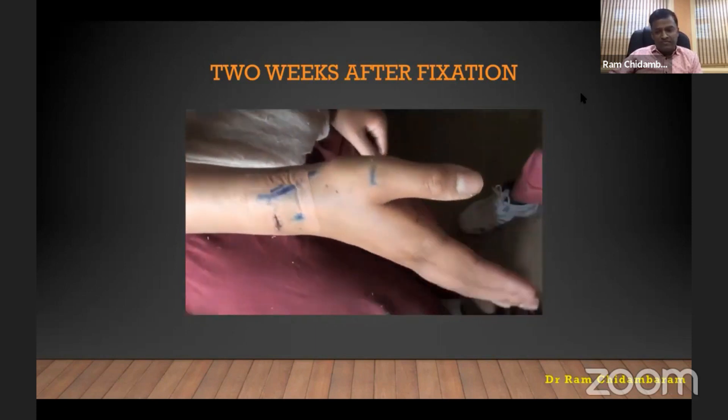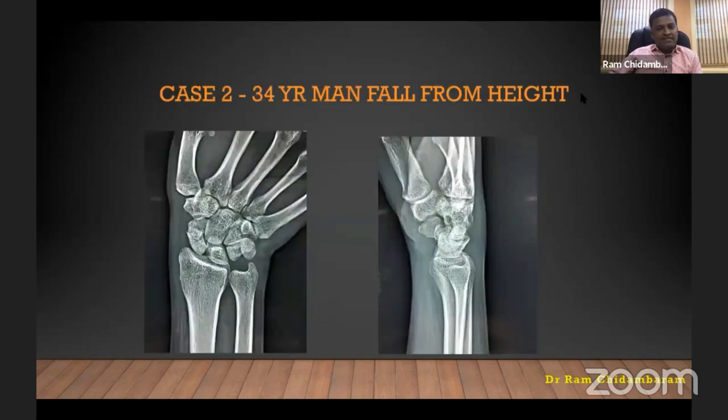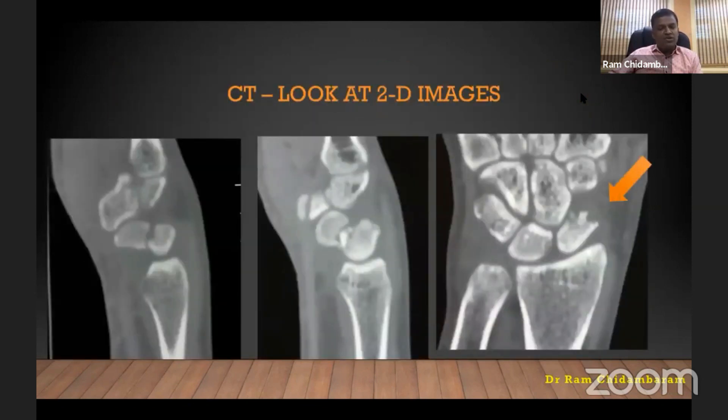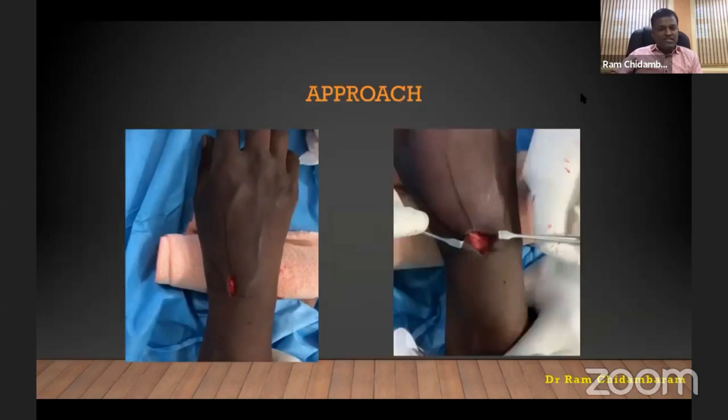The second example is a displaced fracture in a 34-year-old man who fell from height. The 3D CT can be misleading — a very important message: go through the CT scan slice by slice. Because of the oblique anatomy of the scaphoid, you have to view every sagittal and coronal slice. If you see the fracture on the coronal picture only off-axis, that means it is a completely displaced fracture — which is this case.